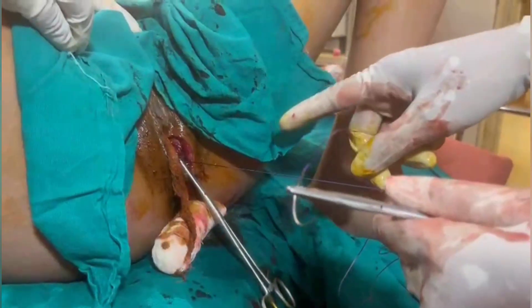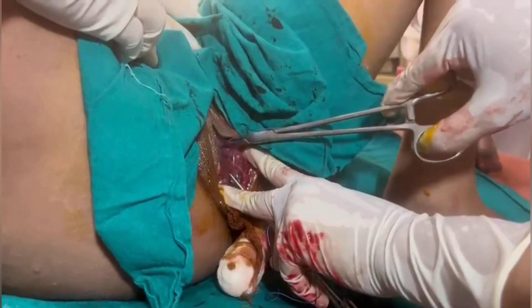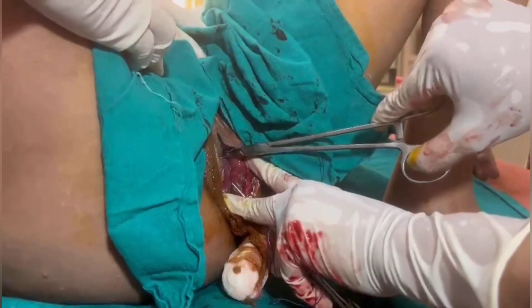I am demonstrating suturing of an episiotomy — mediolateral episiotomy. Always locate the apex. This is the apex of the episiotomy wound. I am probing with an instrument and the first stitch always goes 1 cm above the apex.